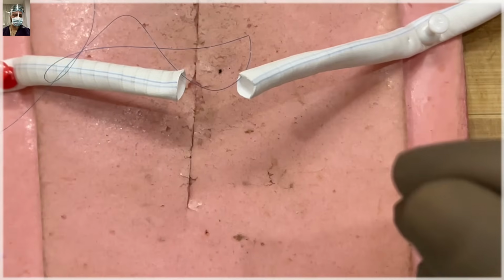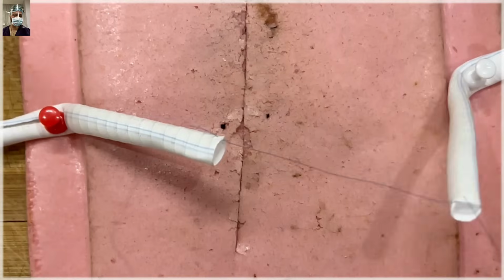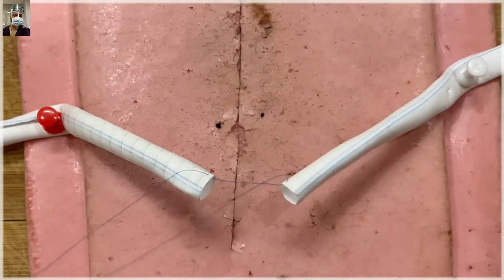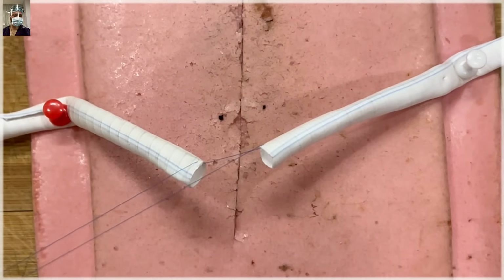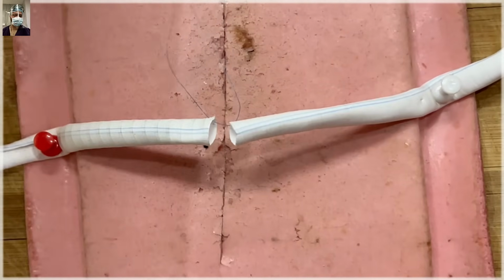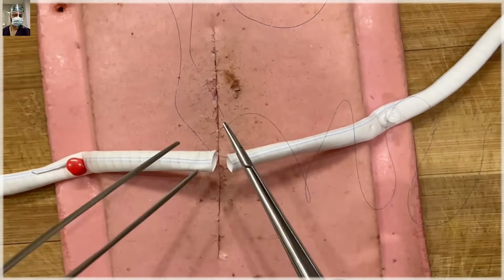So the trick is that we don't tie the corner suture. This will be the 12 o'clock suture we have already taken, and we hold it with a rubber-shod fine mosquito forceps with rubber tubing applied at the end. Otherwise, it can break. So we will hold it in one place, and it should be under a little bit of tension so that the suture ends remain aligned.